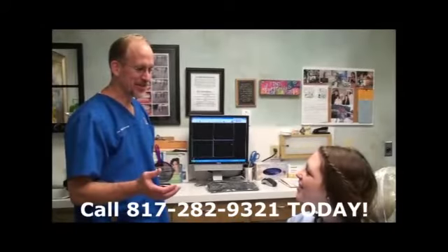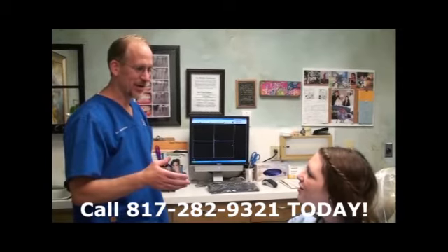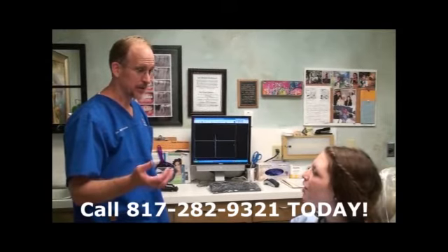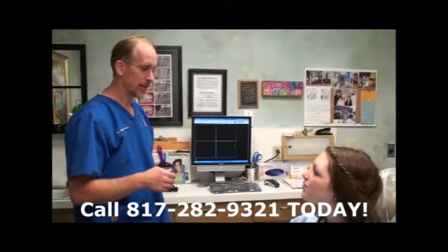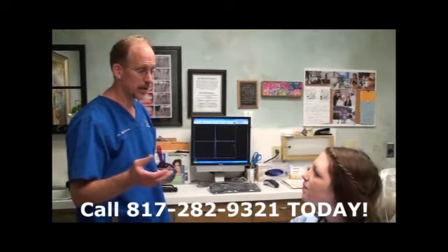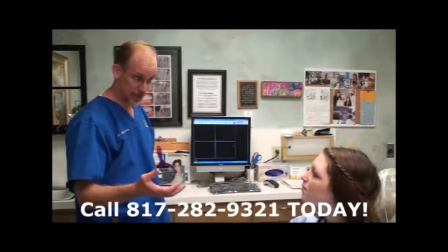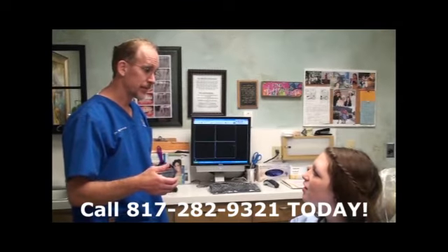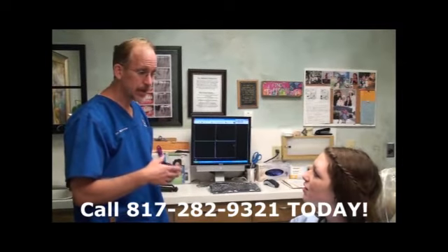Anyway, what we're going to do for you today is take these x-rays and get an idea on whether you have cavities or not. Ideally, we should be able to see if they're in between your teeth or not. A lot of times, if you haven't been to the dentist in a long time, is that right? Yeah. So we should be able to tell together.